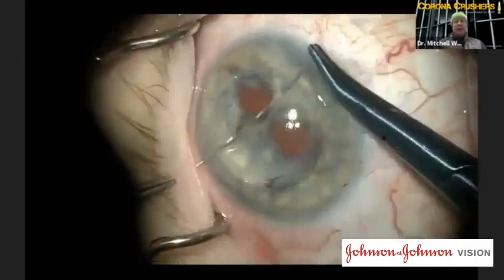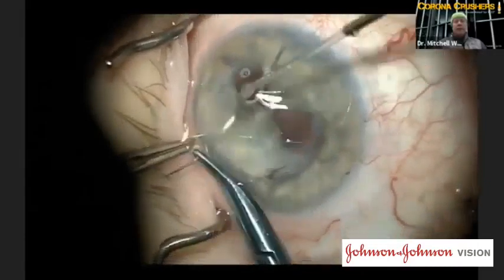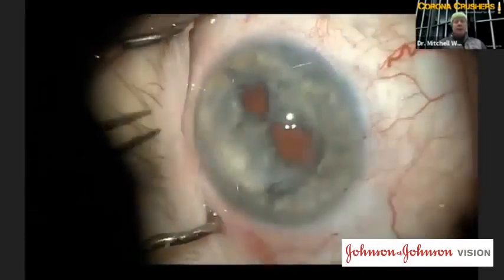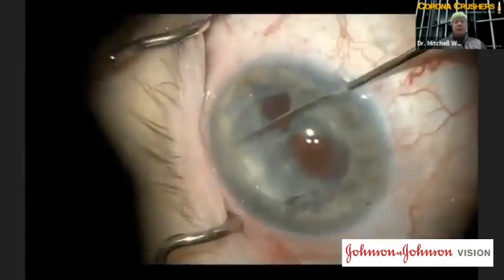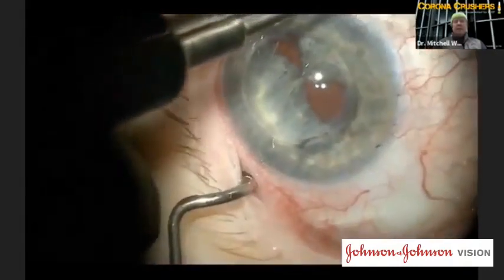And this is a CIF4 needle. Instead of passing the needle through the cornea, what you could do here is dock with another needle. So you come in the other side with a 27 gauge and you dock your needle in a railroad fashion. And we're going to pull our loop through.